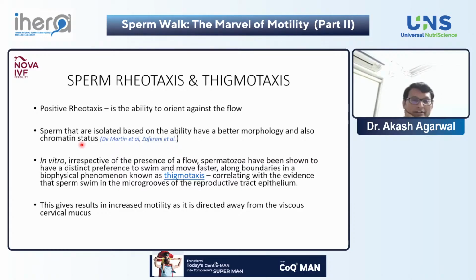In our lab, whenever we load and process a semen sample, the sperms which are most actively motile, if you are making an elongated, flattened PVP drop, go to the corner and stick to the corner, and there they progress much more rapidly. So this is called thigmotaxis.